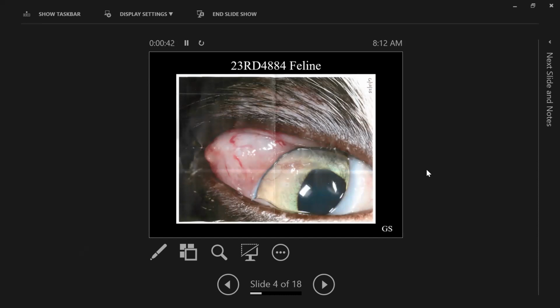Oh yeah, so back to the hemangiosarcoma thing. I would be less worried about that just because of the absolute lack of vascular channel formation. The hemorrhage in this eye, I assume, originated from leaky blood vessels of fibrovascular membranes. But yeah, anyway, who knows? Agreed. Okay, so hemangiosarcoma is lower on my list. Of course, it could be a very poorly differentiated one, and then who knows?